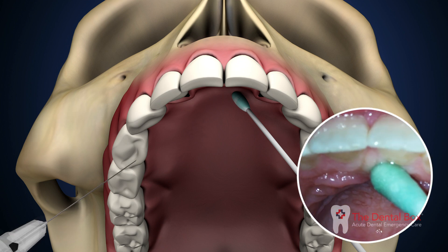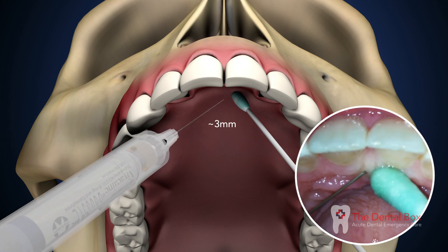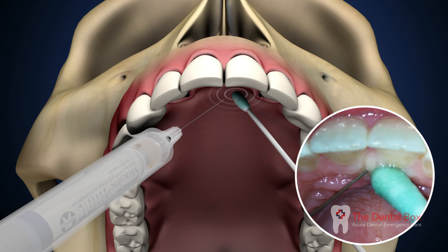Place the bevel of the needle next to the cotton swab and penetrate the mucosa approximately 3 mm. Continue to apply pressure with the cotton swab.